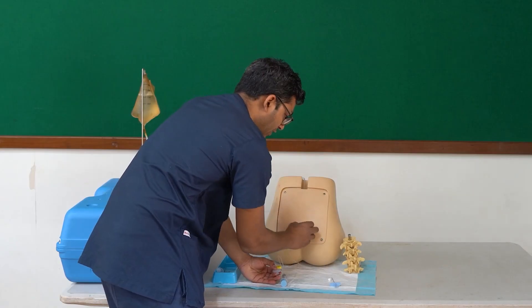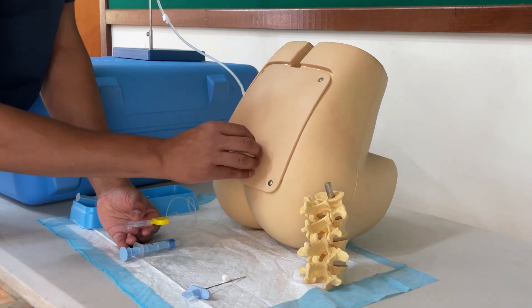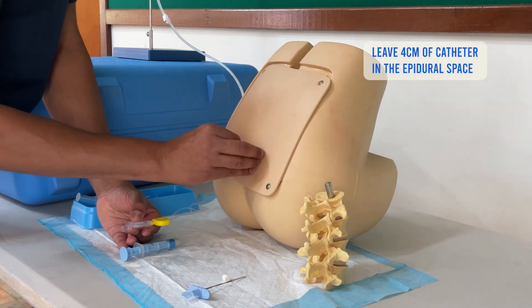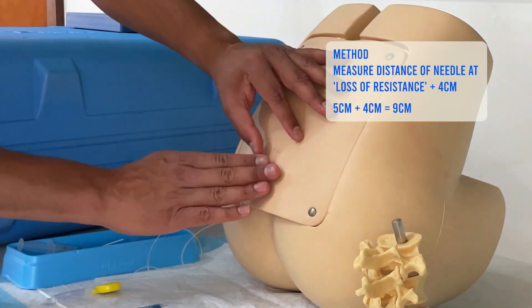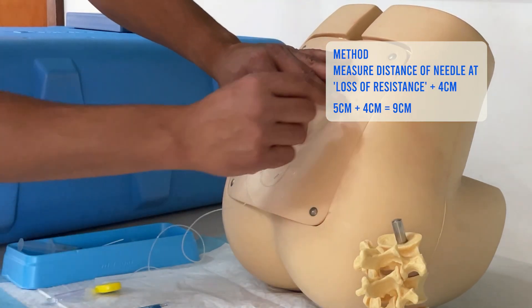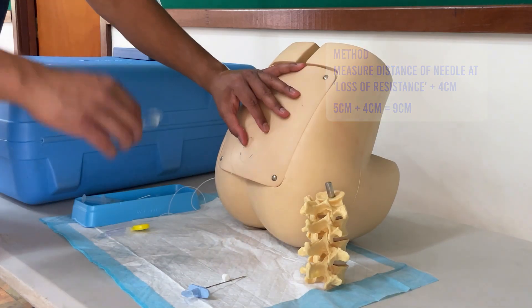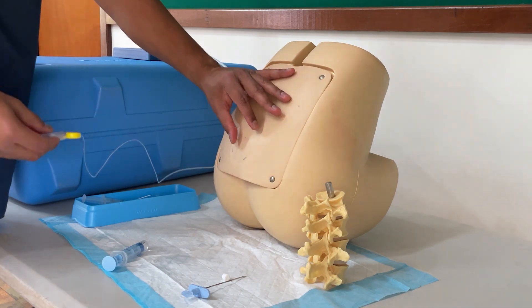How much catheter do I leave in the space? The space was found at about 5 cm, so I generally go down to about 9 to 10 cm on the catheter — leaving about 4 or 5 cm of catheter inside the space. I keep it at around 9 cm. I then stick this down with Tegaderm, ensure the edges are covered with another sterile dressing, and have the catheter running up the patient's back so I can bolus dose as needed.